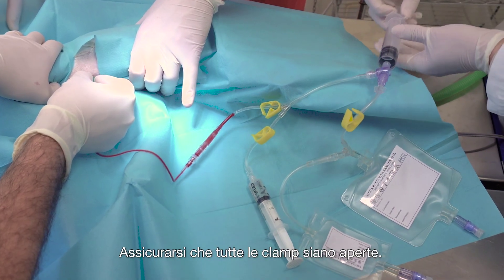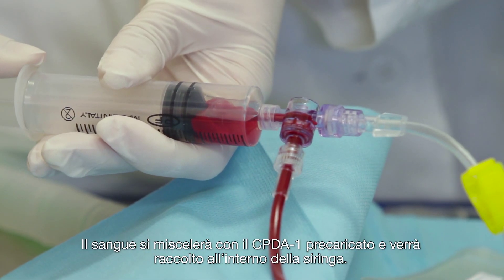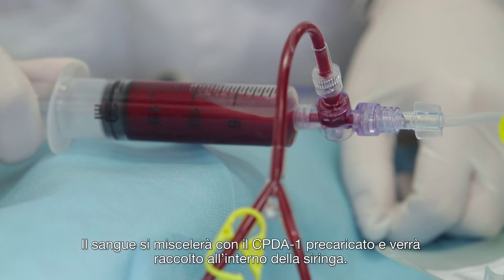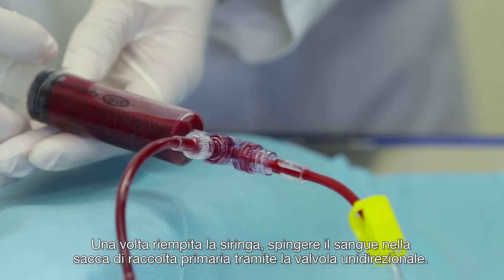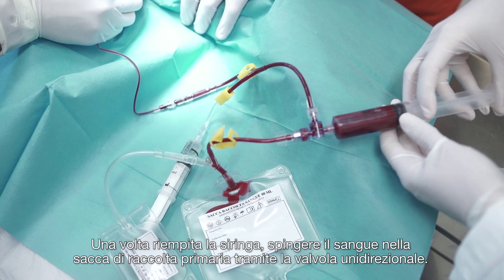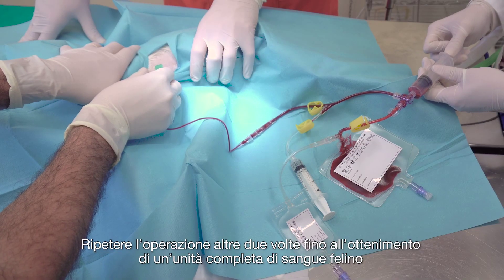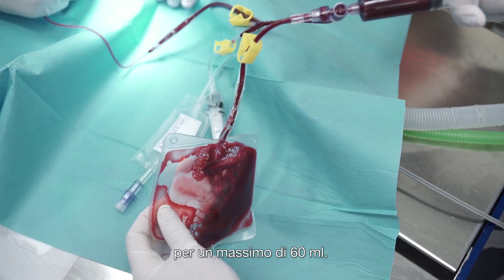Check that all clamps are open. Gently proceed with the aspiration through the 20 ml syringe. The blood will blend with the CPDA-1 into the tubing and will be collected into the syringe. Once filled, push the syringe plunger. The blood will pass through the unidirectional valve and will be collected into the primary bag. Repeat the operation twice to obtain a full unit of feline blood, for a maximum amount of 60 ml.